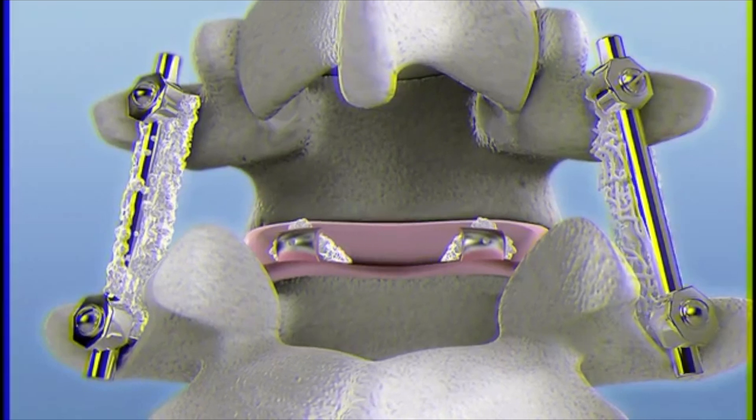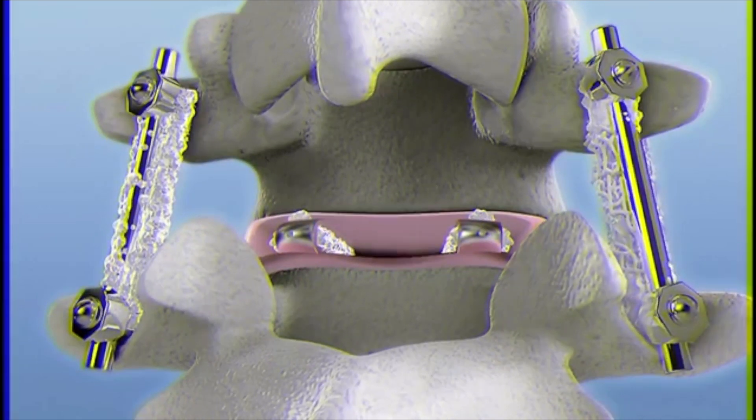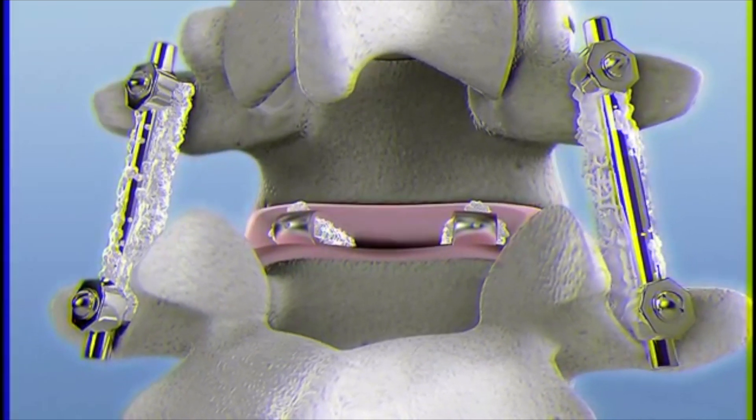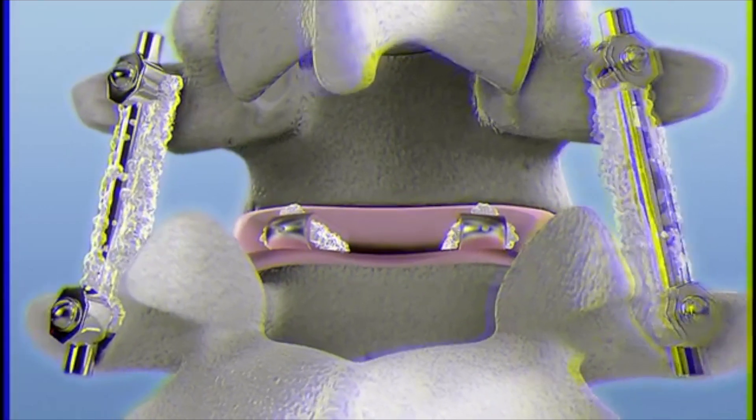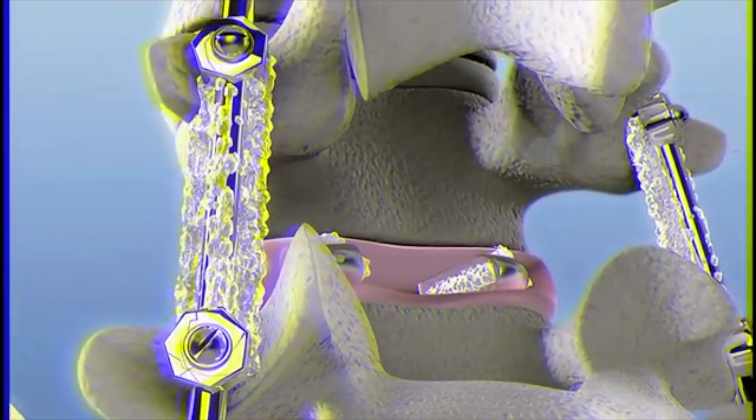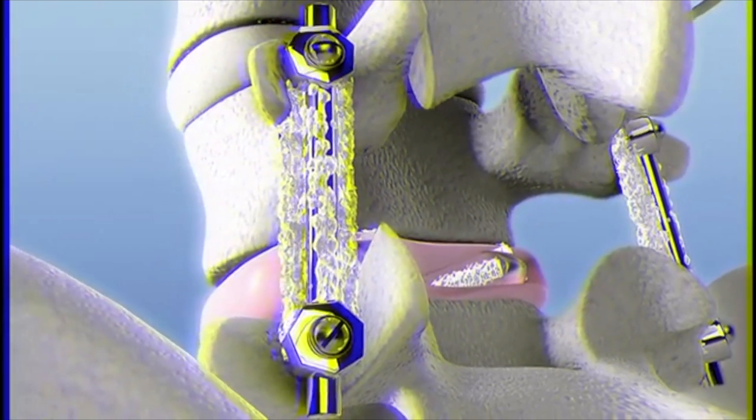In traditional synthetic bone graft substitutes, bone growth proceeds inwards from the edge of the host bone towards the center of the defect. In contrast, Inductograph promotes bone growth throughout the graft due to its osteoinductive properties.